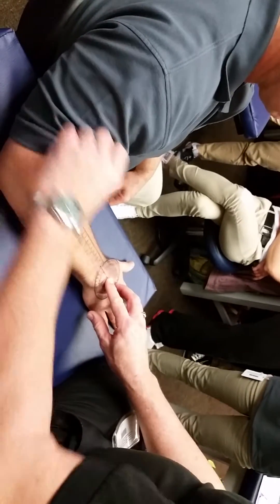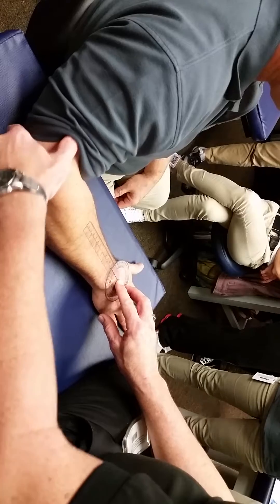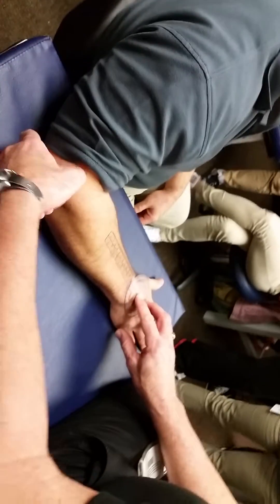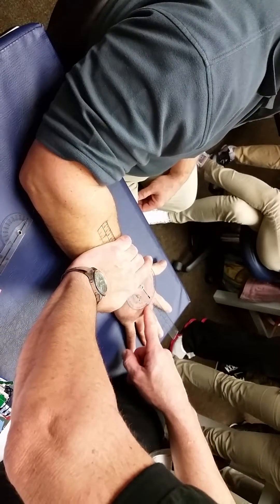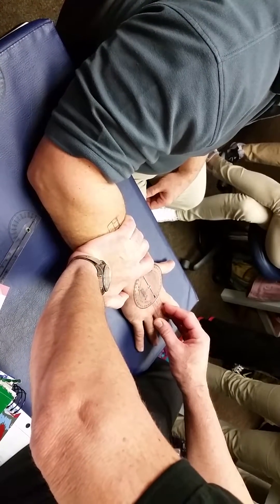I'm going to put my axis there, midline of the forearm — it's kind of pointing toward either the lateral epicondyle, or if you could see it, the olecranon, but we'll use the lateral epicondyle. And then the third metacarpal, which is this knuckle. So what I want you to do is turn toward your little finger.